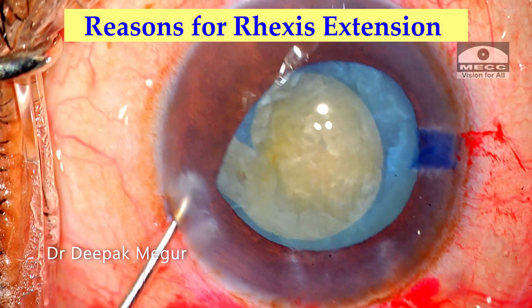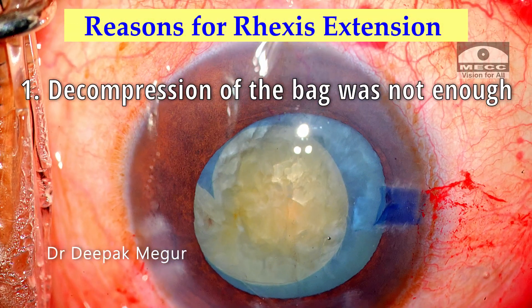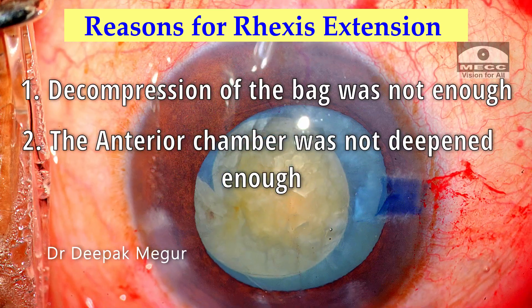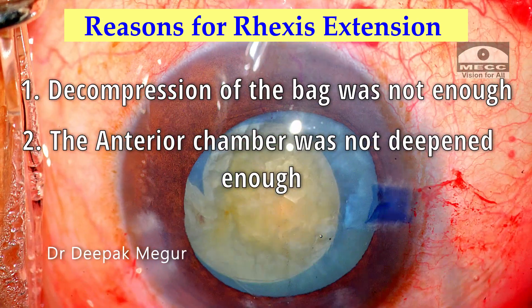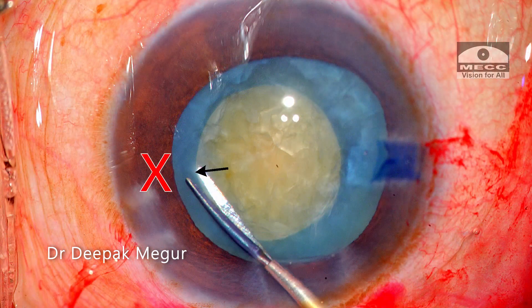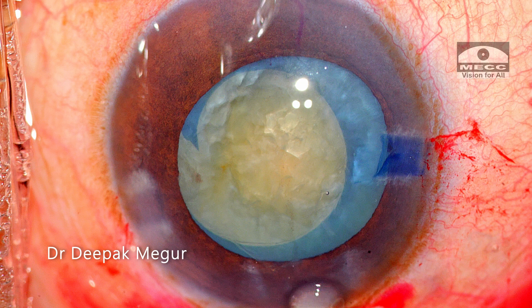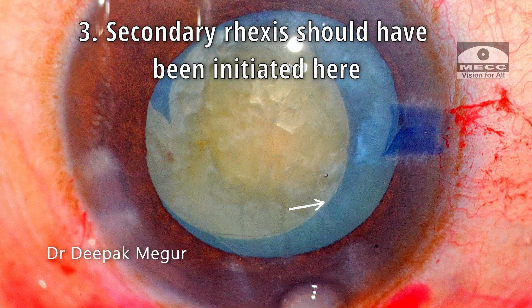There are three reasons for it running away. Number one, the decompression of the bag was not good enough. Number two, the anterior chamber was not deepened sufficiently before tearing the flap. And lastly, the anterior capsule edge at this quadrant was much closer to the equator. The other quadrant of the rhexis was ideal to begin the process of enlarging, as it was much further away from the equator.